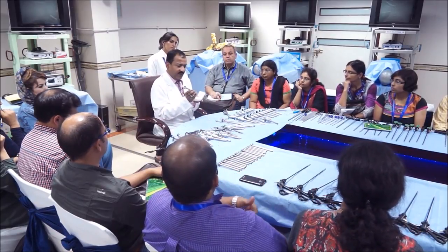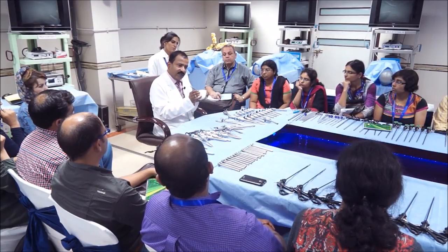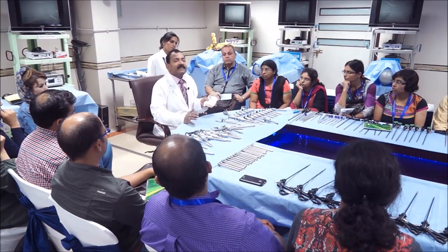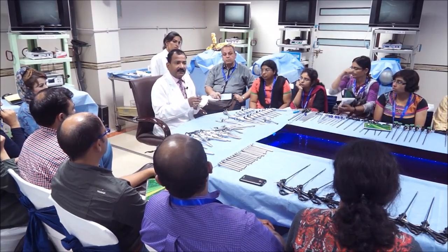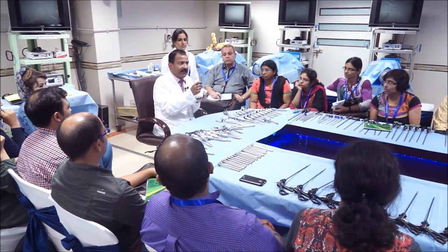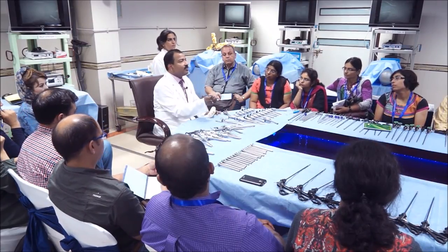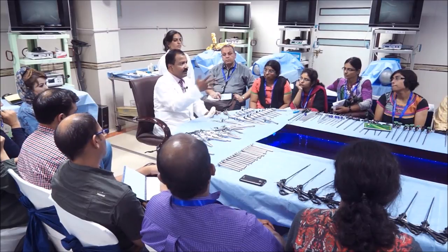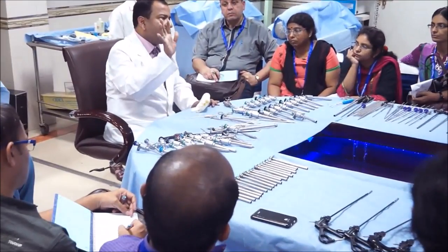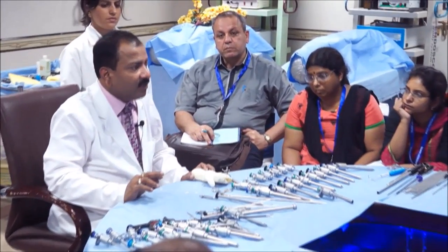So this should be perpendicular, and the idea of going backward means going towards the anus, so that we escape the great vessels. After that, once the pneumoperitoneum is created and the abdominal wall is distended, it automatically becomes perpendicular. It is not like that if you are doing cholecystectomy, then you cannot point towards the anus, because once the abdomen is distended, it will again become oblique and then the trocar will sew you up. There is no problem in that. So this was how the Veress needle should be held.